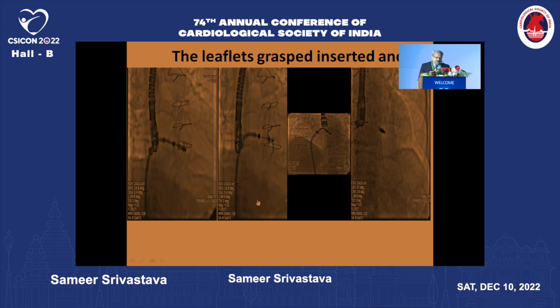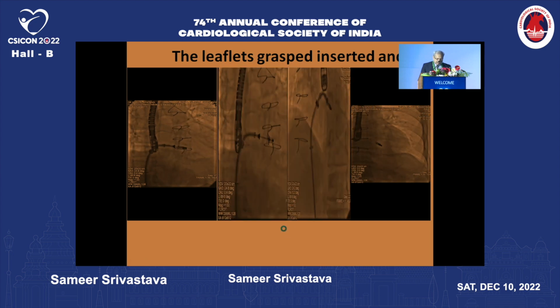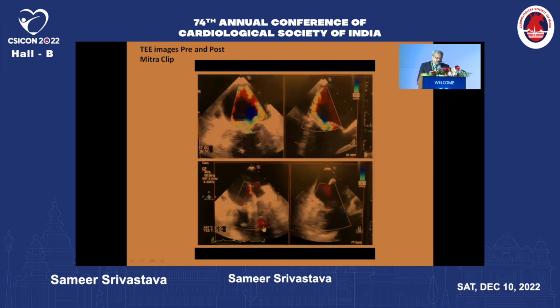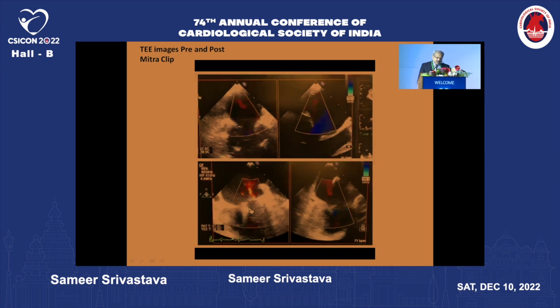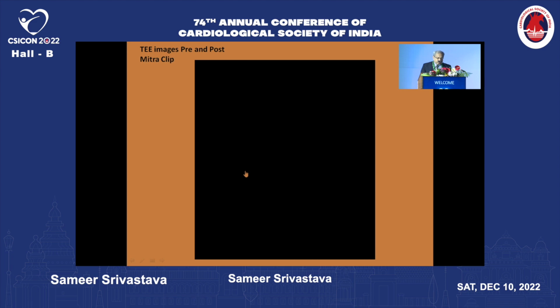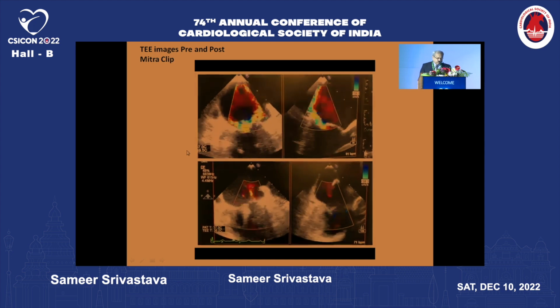These are the leaflets which are to be grasped, and once you see it happen, you're sure that you have done a good job. Most of the times, people will think that they have done a good job. Again, if this were to be the plane of evaluation, the top ones are pre-op and the bottom ones are post procedure. And if you look at this, you are really happy. But unfortunately, we have not quantified it, so what is the issue.